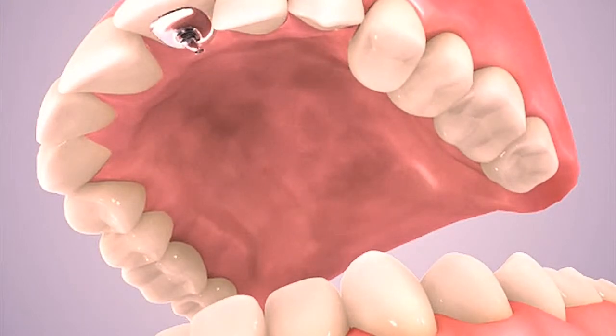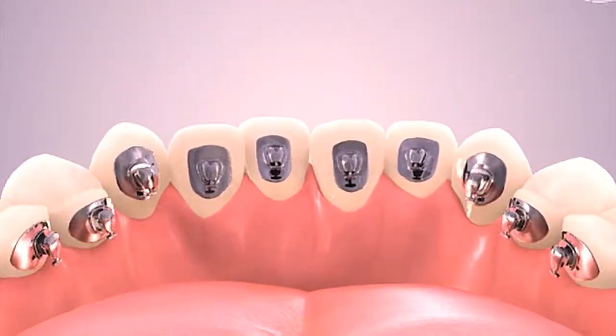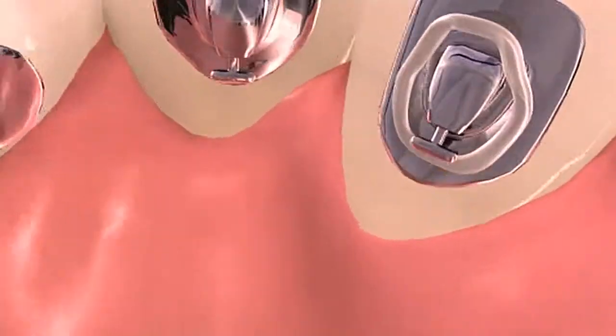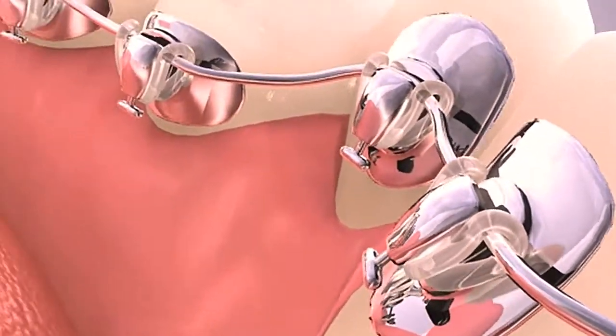A series of metal brackets and wires are used, just as in conventional braces, to correct crooked teeth and malocclusions. All of this hardware is placed behind the teeth where it cannot be seen.